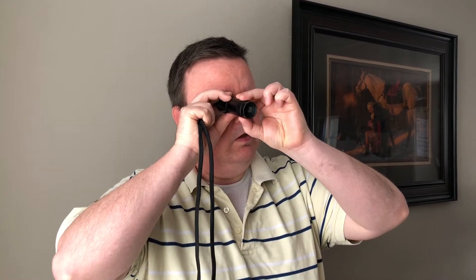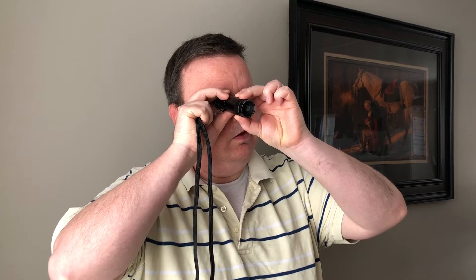It helps when using a telescope to pre-focus it to the distance you want to view. You can do this by holding it up next to your eye and twisting it until it's in focus. Then the next time you use the telescope, the target is already in focus when you look at it. This helps to reduce the amount of time it takes to view what you want to see.